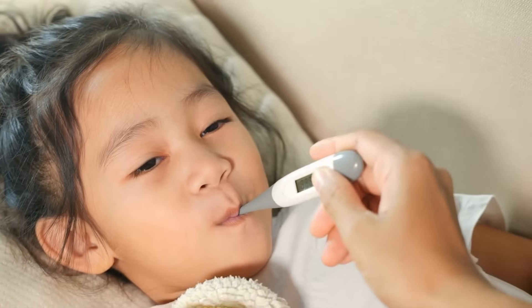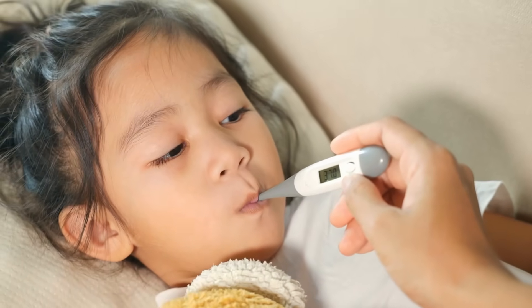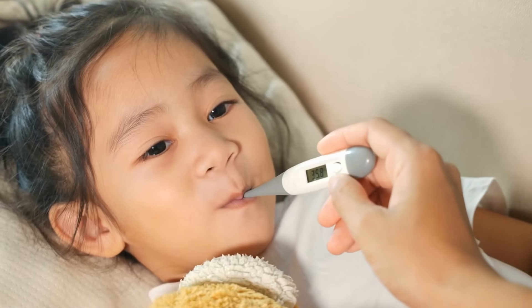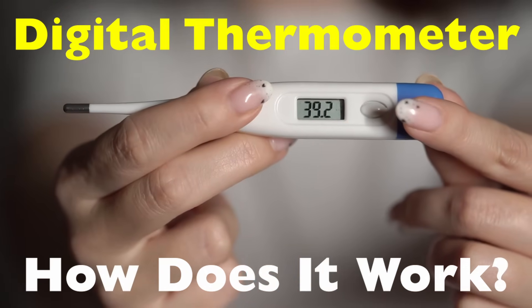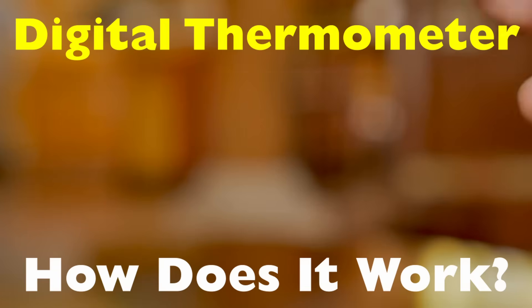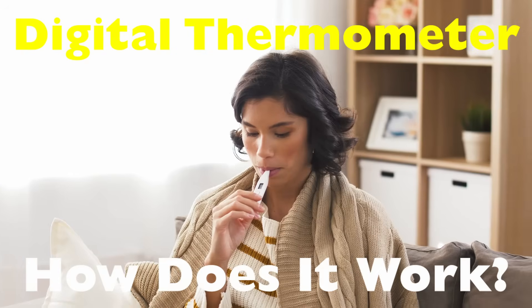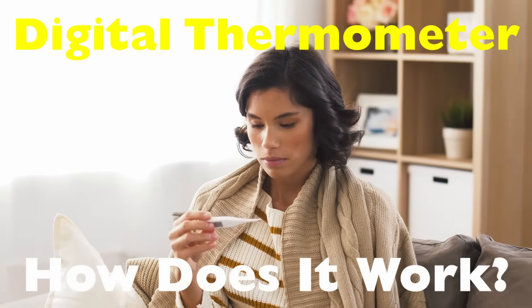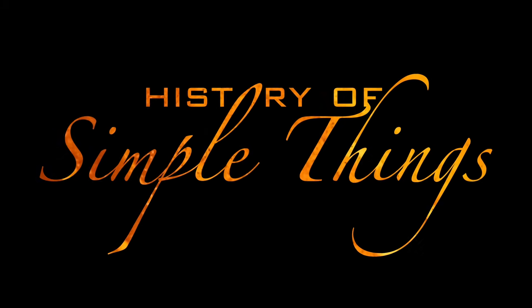Have you ever wondered how that small device you place under your tongue or against your forehead gives such an accurate temperature reading in seconds? Today we're breaking down the inner workings of the digital thermometer. By the end of this video you'll know exactly how it works, what's happening inside it, and why it's become the go-to tool for measuring body temperature. Let's dive in, right here on History of Simple Things.